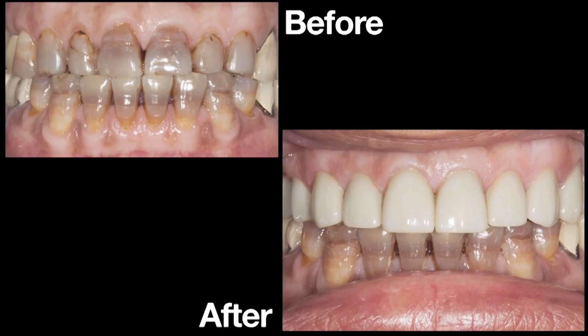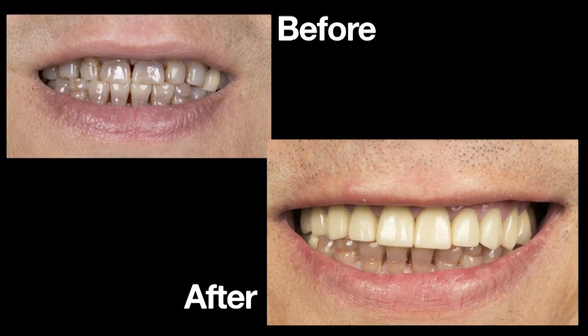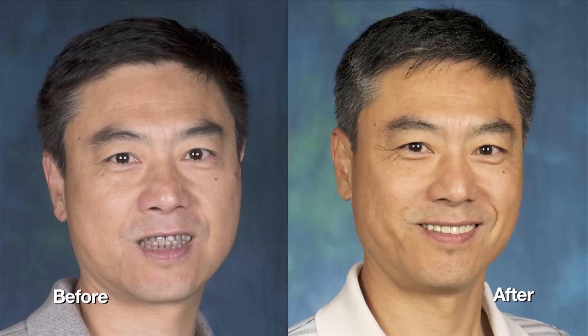We go ahead and place all those crowns, and through the magic of morphing software you can see we go from the tetracycline befores to the Bruxer afters. Is that the most aesthetic set of crowns you've ever seen? Not likely, but look at what a huge improvement that is for him. It'll be a little while before we get to his lower anteriors, as we have other patients eager for this treatment. You can see his smile on the left and the relaxed nature on his right — his face just kind of lights up a little more, the smile looks more natural.